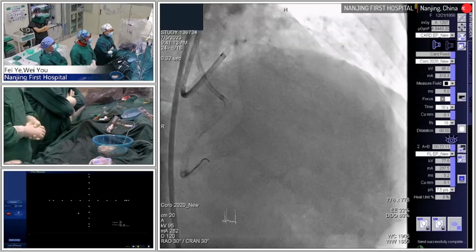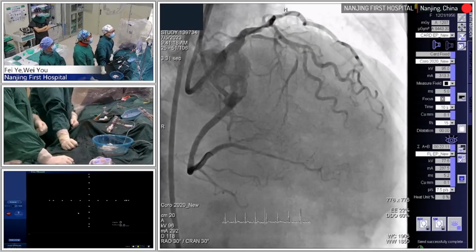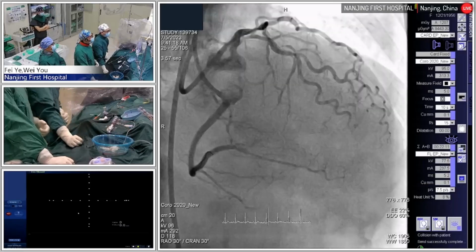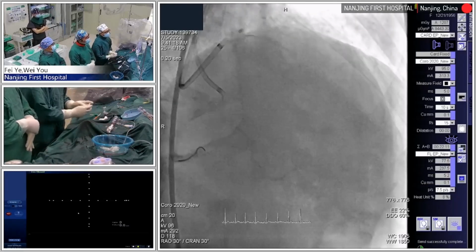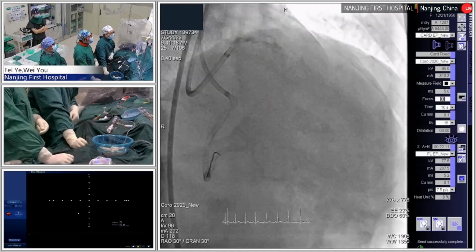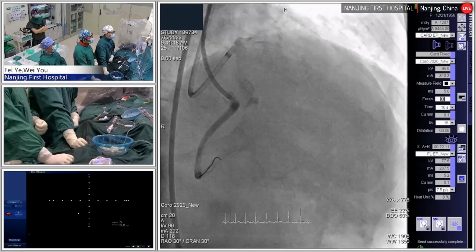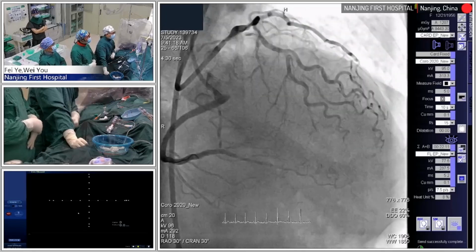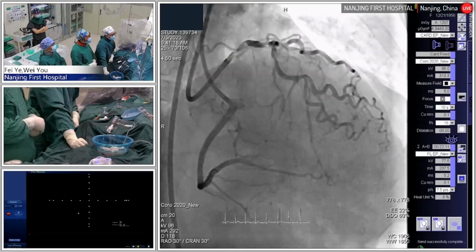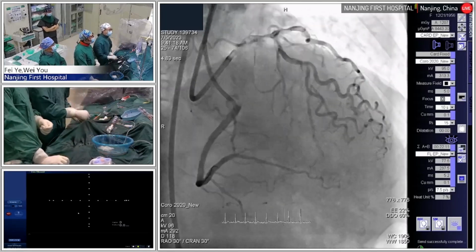You can see the bilateral coronary angiography, because of the total occlusion in the middle segment of the LAD. Unfortunately, we cannot find the contralateral collaterals from the distal PDA. It's also the common contralateral from the PDA through the septal to the LAD. But because it's an equivalent distribution of the coronary artery, we cannot find the contralateral collaterals from the distal RCA. The main collateral is just ipsilateral, from the obtuse marginal to the second diagonal. It's also the common epicardial collateral for the left coronary artery.